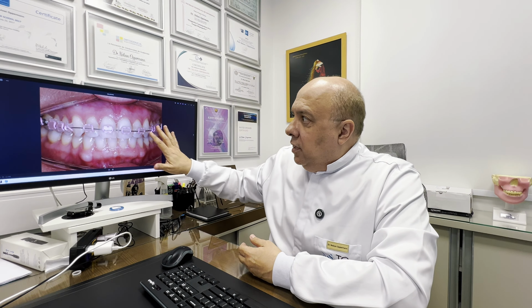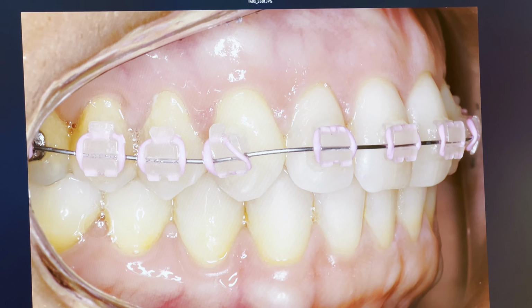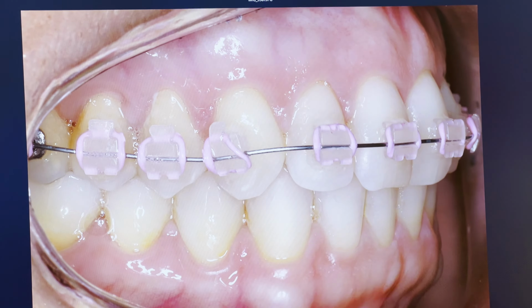So I am not going to use the anterior teeth guidance because I will change it with my orthodontics. So this way, when we mount the case, I will start working with the upper jaw because I need to open the guidances. I cannot keep canines blocked like that. I can start with a simple straight wire in the very beginning, but this is not a case for full treatment straight wire, I mean. So we will align, remove this interference here.